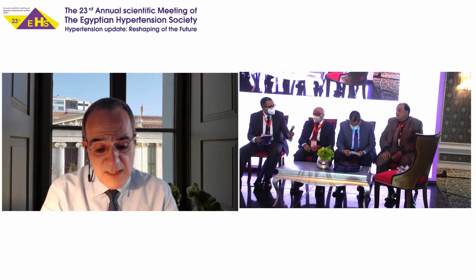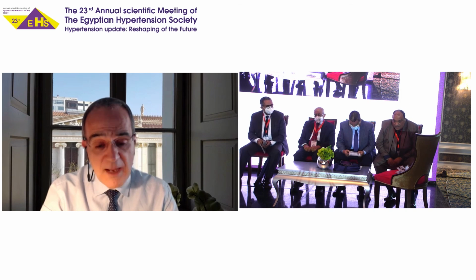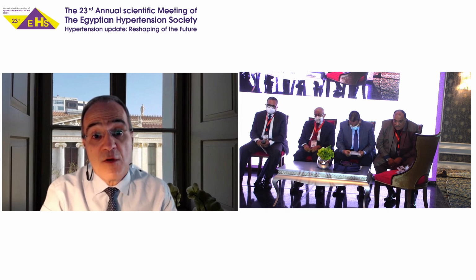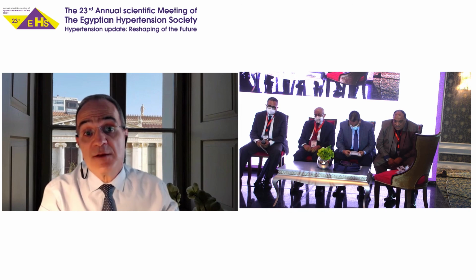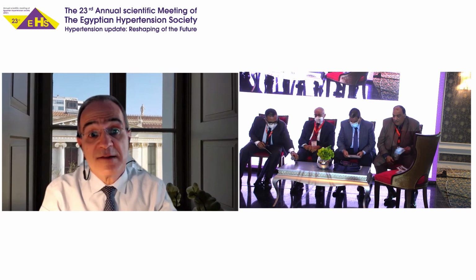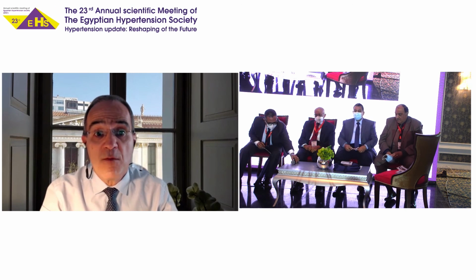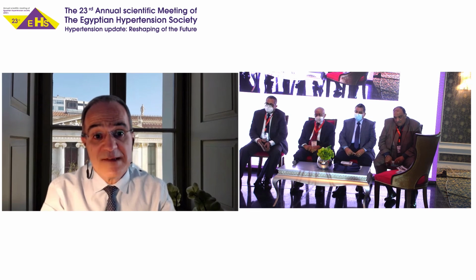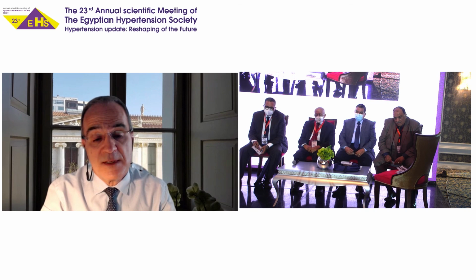I have also to tell you that in my clinic, we have a model where we have home monitors. These are very low cost, 50 euros. Ambulatory monitors cost more than 600 or 700 euros. So we have home monitors, which we give to patients for 5 days, which is much less expensive than using ambulatory monitoring.